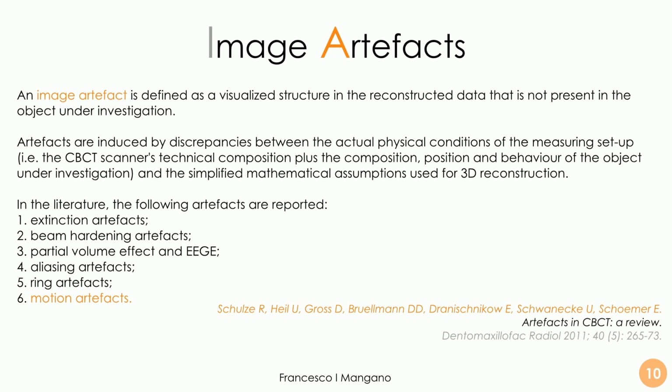The point is to avoid image artifacts. An image artifact is defined as a visualized structure in the reconstructed data that is not present in the object under investigation, so in reality. Artifacts can be induced in several ways, and there are several kinds of artifacts.